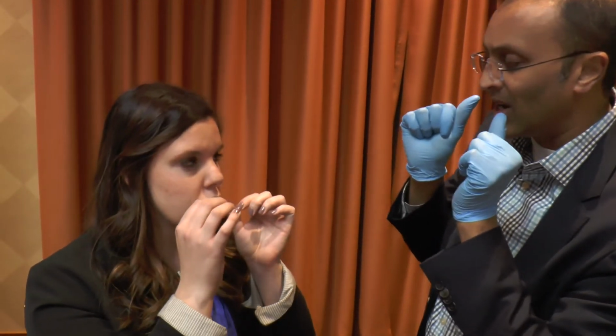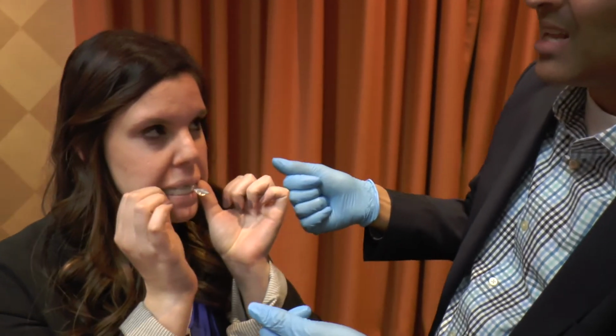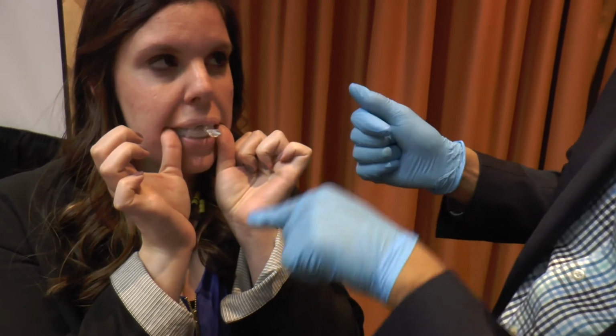To remove the device, if retention is very tight, have your patients take their fingers and go up on the lower tray and slide as far back as you can. As they lift up with their fingers, I want them to open their lower jaw.